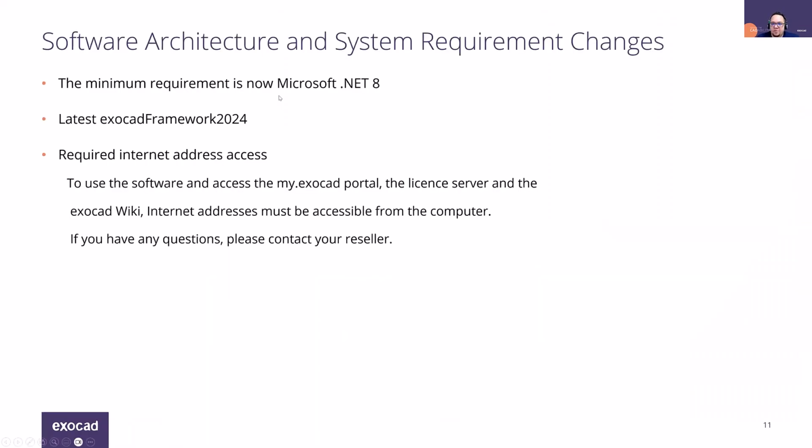From a software architecture and system requirement change, the minimum requirement is now Microsoft .NET 8. Our latest exocad framework 2024 has been updated to match Windows updates and requirements for our software to function properly. So there are required internet addresses that our software would need to access. You can see those within the change logs of the software. And just a note, if you have any questions about that, contact your reseller for those specific URLs.